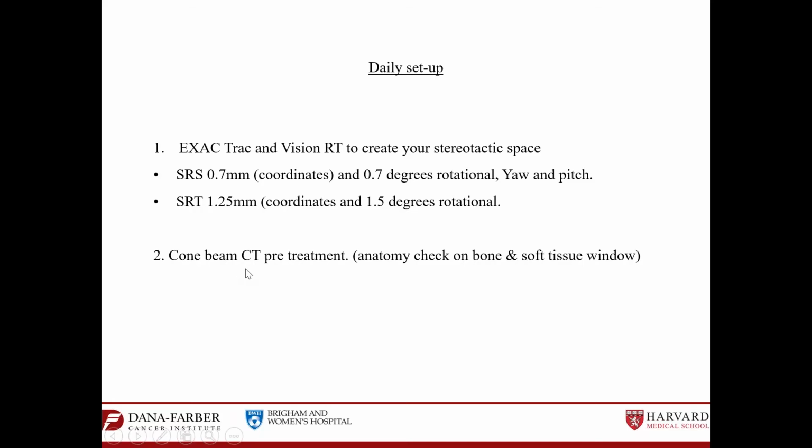Whenever you are on the linac and the therapist calls you to approve the immobilization of the patient, you're looking at the cone beam CT in the axial, coronal, and sagittal. You will look at it in the bone window and in the soft tissue window. You're trying to match the sulci and gyri of the brain, the ventricles, and the brainstem location. Do not look at the skull.